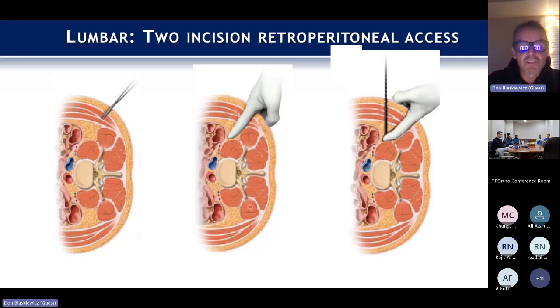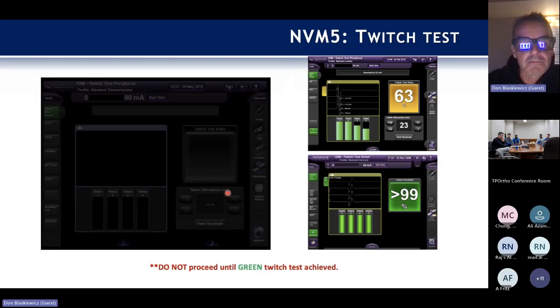We know the 2-incision technique, making that posterior incision, getting in. I still do this. I'm still like a purist in that sense. I still will do two incisions, even for a disc. I'll get in, I'll free everything up, particularly in thin patients. A lot of times that descending colon's there, and you can push it forward with your finger. If the kidney's there, if you're up higher at L2 or something, you can sweep that anteriorly. So I still use this technique.